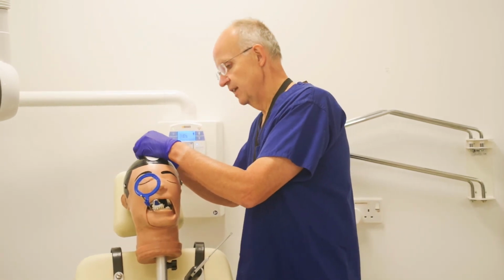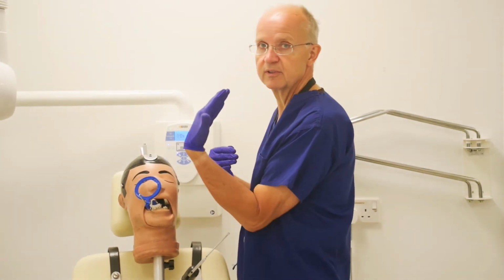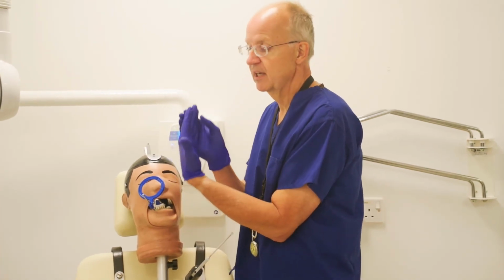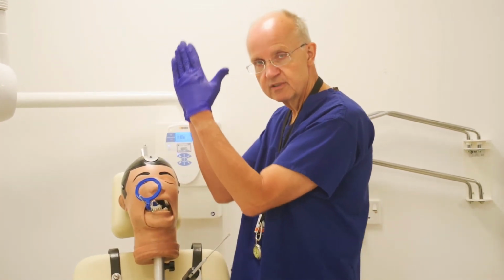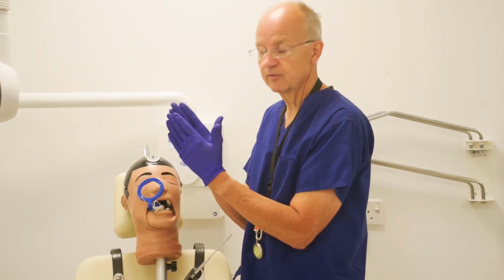If we don't have it straight, what happens is the film will tilt to one side, and because it's narrow and thin, and we've got it in the vertical orientation, which we have to in the front of the mouth, we risk missing the apex of the tooth off the image. So always try and make sure that your film is nicely lined up along the long axis of the tooth.